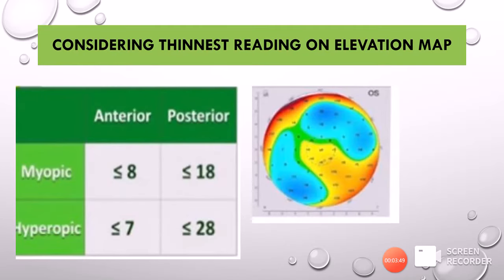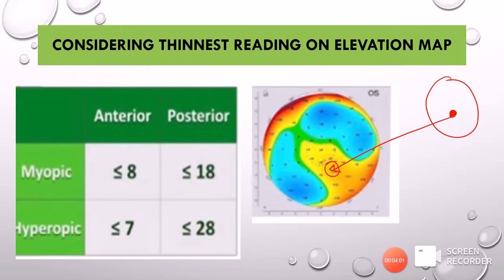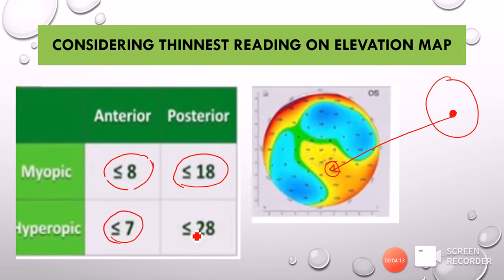Another important step on the elevation map is to find the location of the thinnest point on the pachymetry map and find the corresponding elevation of that thinnest point on the elevation map. In myopia, the anterior elevation map at this point should be less than 8 and the posterior elevation map less than 18. In hyperopes we take it as 7 and 28. So if values exceed 8 and 7 on the anterior, or 18 and 28 on the posterior, in myopes and hyperopes respectively, it is a risky case.